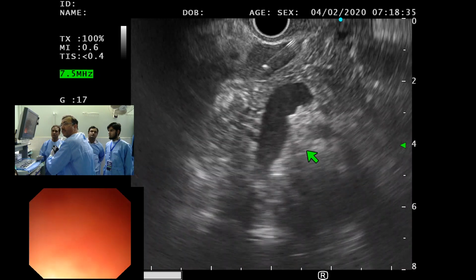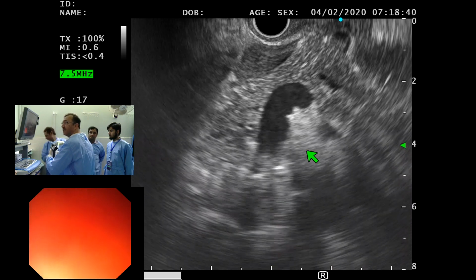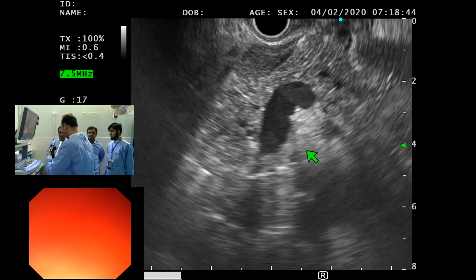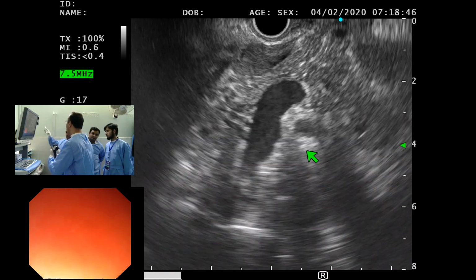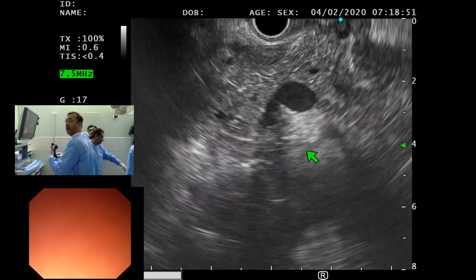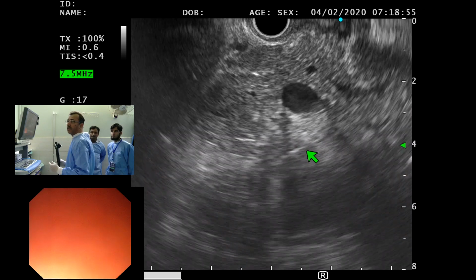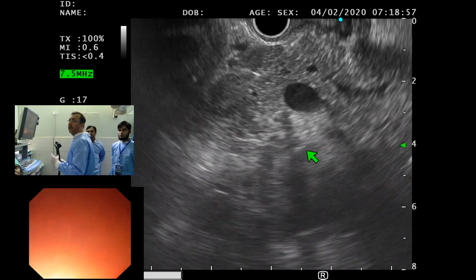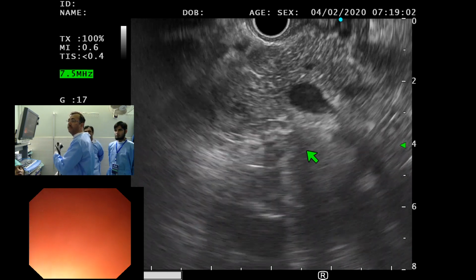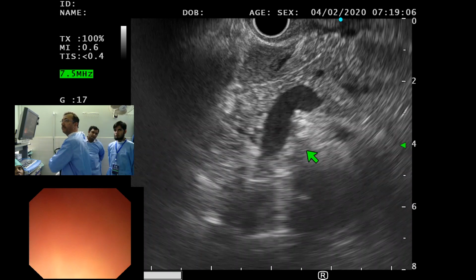So how many punctures do you make, Riyas, with the FNB now? Generally, I make 2 or 3. It all depends. I also follow your routine, as long as I'm guided by my colleague, whosoever is reading the slides. If he says that you got the core, you got the tissue, and we have got the diagnosis right on the first pass, I may stop there. But generally, minimum 2 passes we do make. Okay.